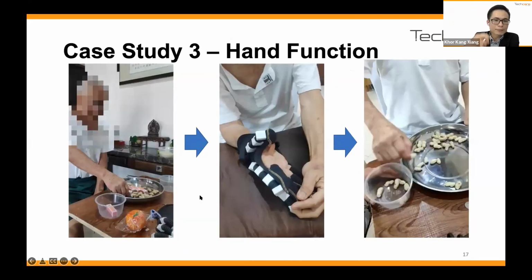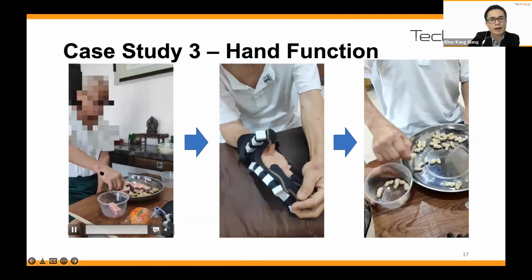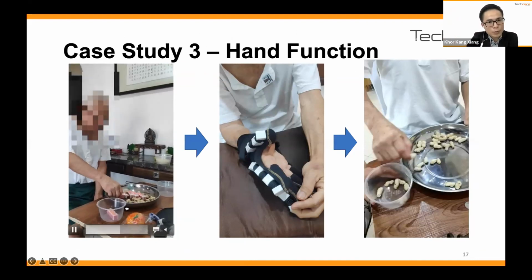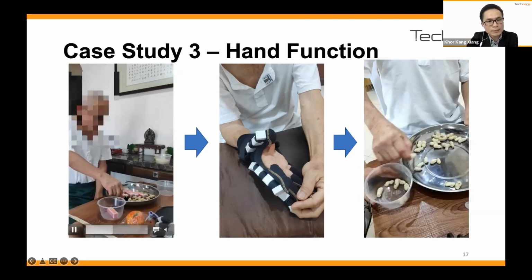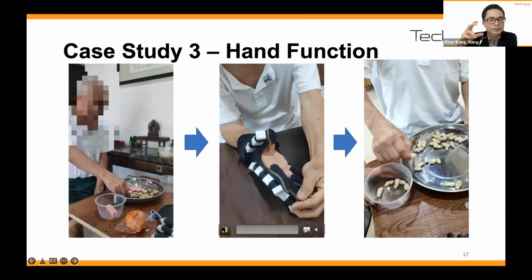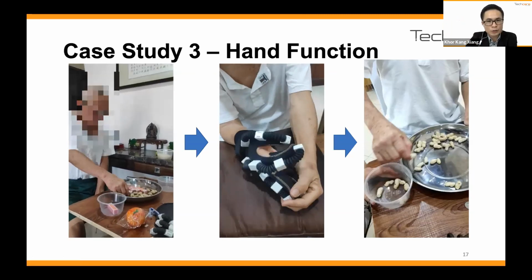Well, even though we can improve the hand function, if we do not improve the elbow, they are actually not able to have that kind of function as well. So while doing different kinds of function, we will see what kind of movement they require. For example, this is a pick and place movement. They are not able to do a pick and place. We can customize the movement of the robot by selecting the pinching movement. This is an example of how they can do a pinching movement.